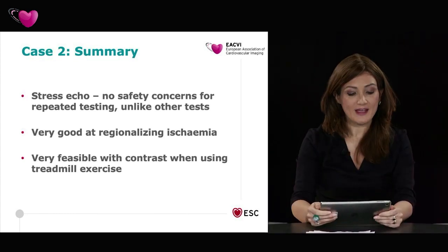Thank you, Raj. Now, a lot of questions are coming regarding safety with contrast. What is your experience about allergic reaction? In the published literature, we quote a complication rate of 1 in 10,000 with contrast, which is very, very low, of an allergic reaction.